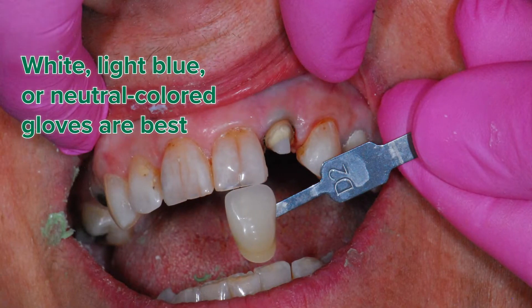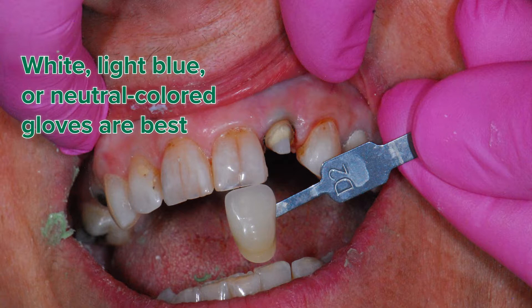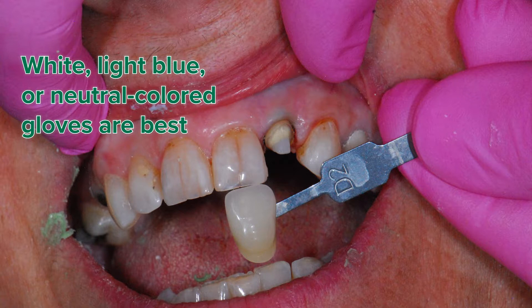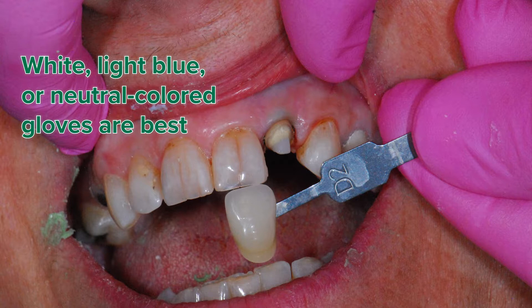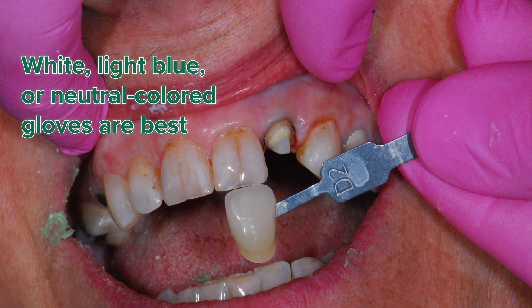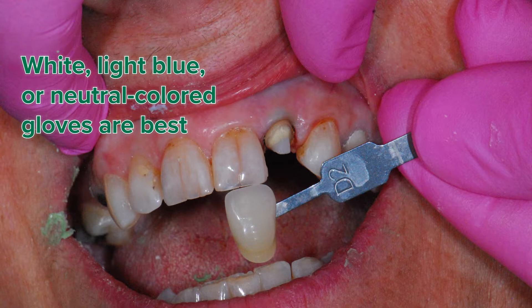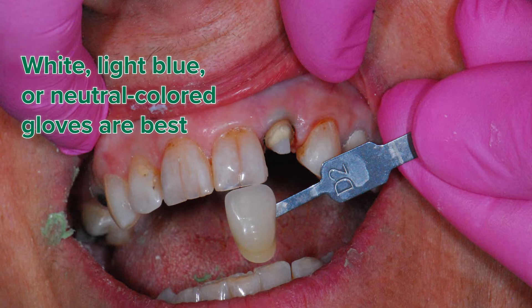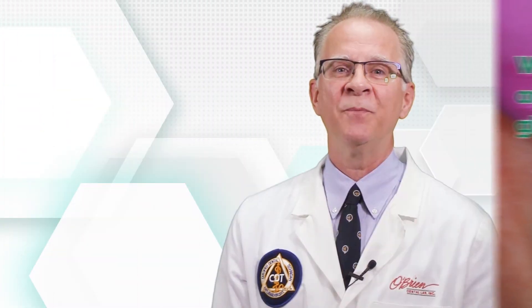And those colorful gloves? They affect what we see. Use only very light blue, white, or neutral colored gloves. And always have a shade tab represented in the photo. Even if it's a difficult shade to determine or lighting variations are present, having a point of reference for the lab gives us a standard to compare the teeth to.